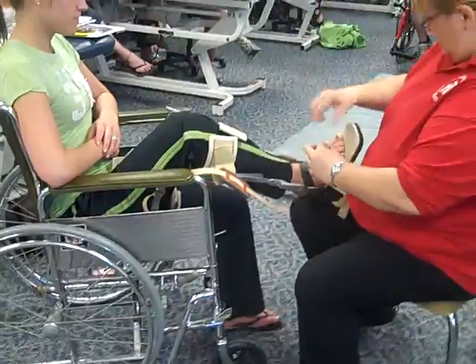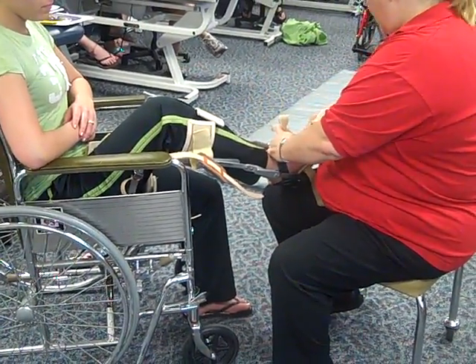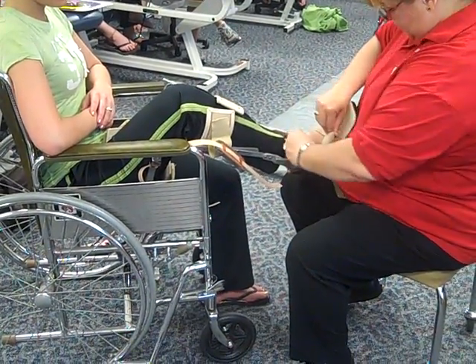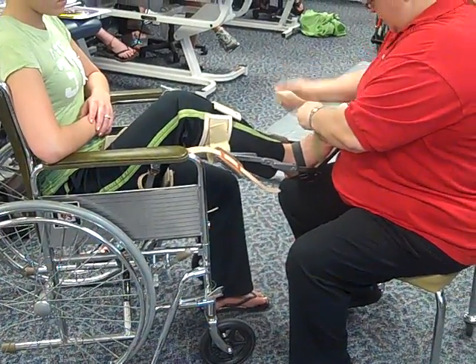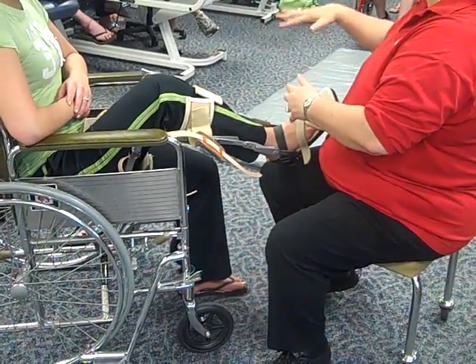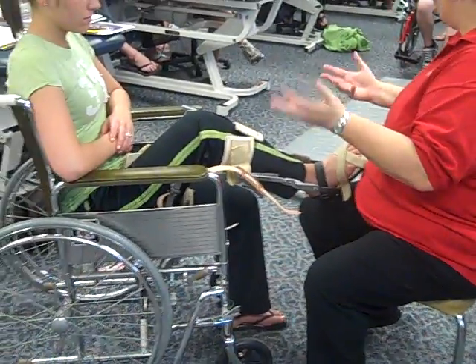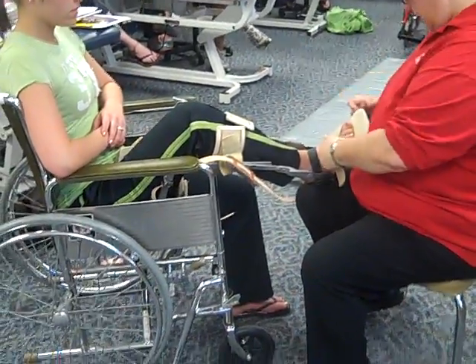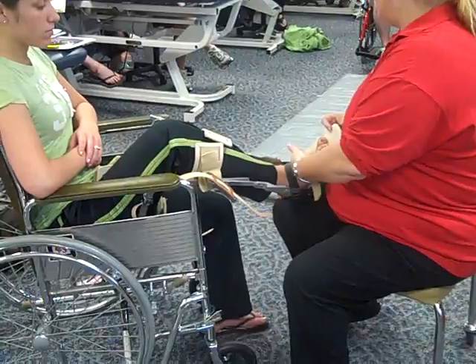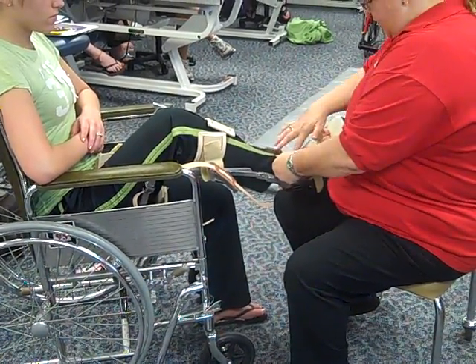These others criss-cross. This one comes across — they're sewn right on there so that they go into a criss-cross pattern. One going down that way and then across that way. They need to be pretty firm; you don't want the patient coming up away from the actual brace itself. The patient doesn't have sensation, so I can't ask if it feels too tight. I'll just stick my finger in there — I should just barely be able to get my finger in there. Same thing here: I can put my finger in but just barely.